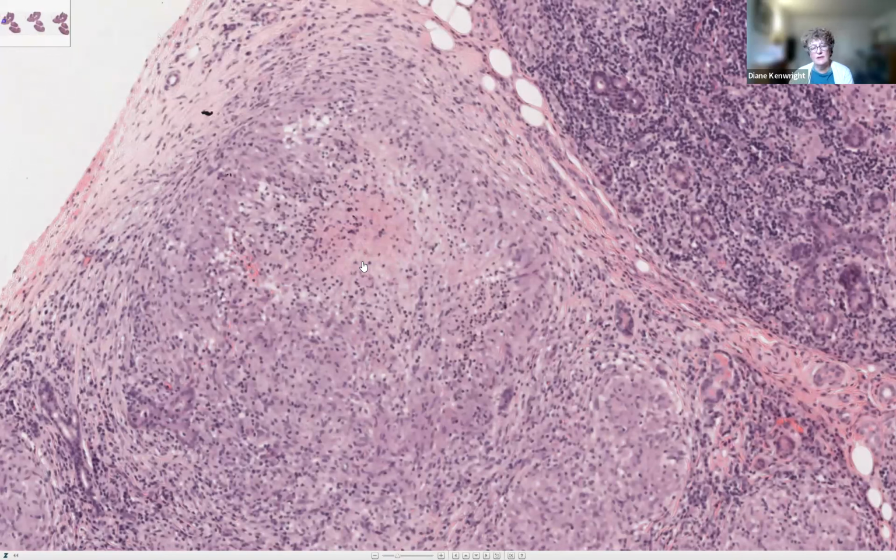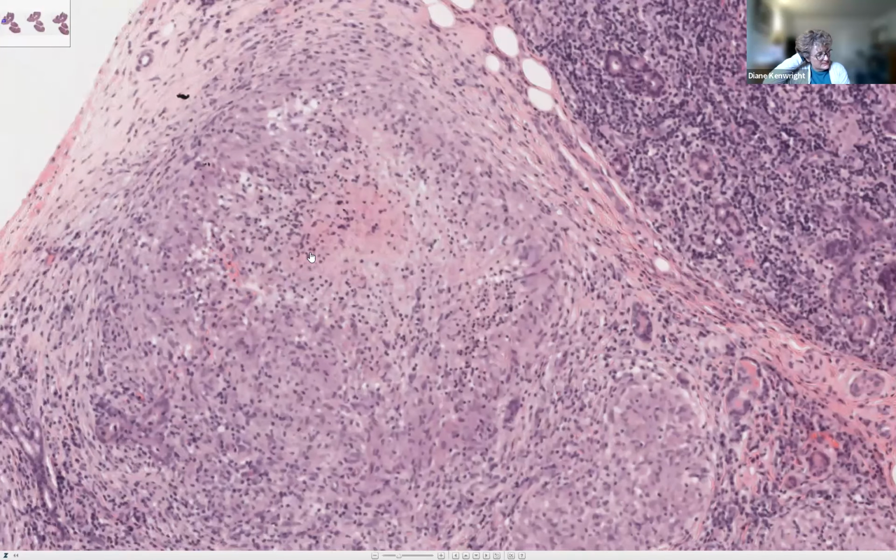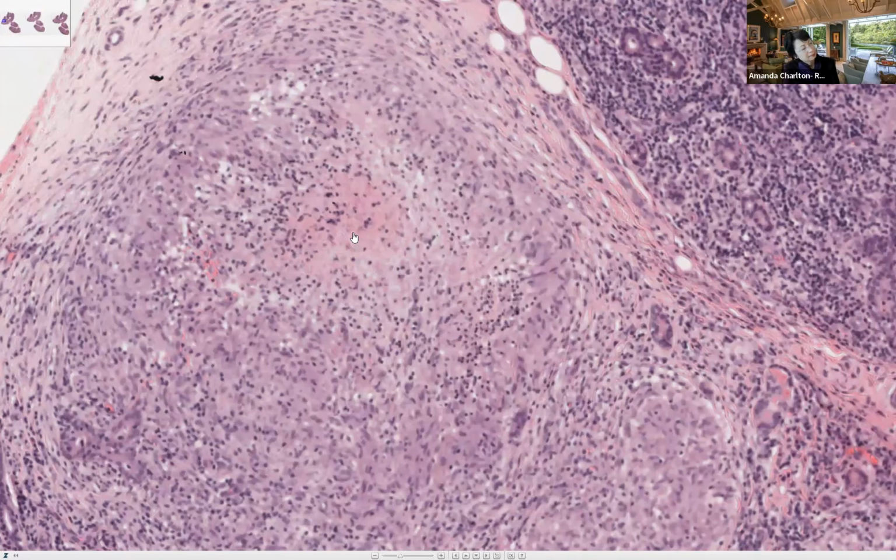So there, it's looking very degenerate in the middle there, isn't it? So sometimes you get breakdown in the middle of these sarcoid-like granulomas. In fact, about 10% of them will have this central breakdown. This doesn't necessarily mean that we're thinking of TB here, because the majority of them aren't. So you can't actually definitively call a disease depending on just what one or two granulomas look like.